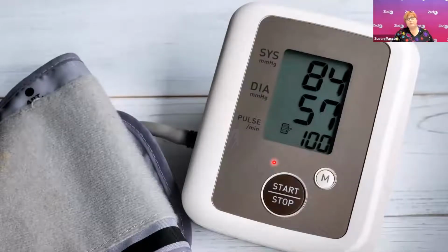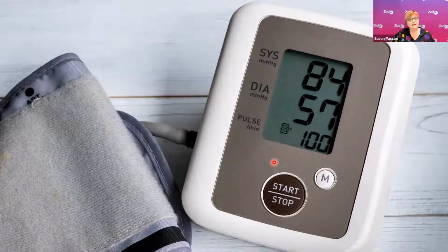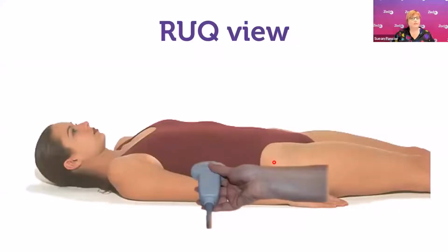Now, the thing is, when you have a patient that has a low blood pressure and they present in pain, it suddenly doesn't become about finding a pregnancy. It's all about the FAST exam. And this next place, if you see free fluid in the pelvis, the next place you would look is in the right upper quadrant. This is for the women. This is the second deepest part of the peritoneum.